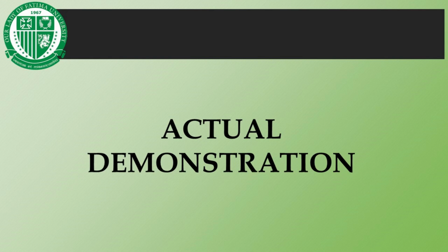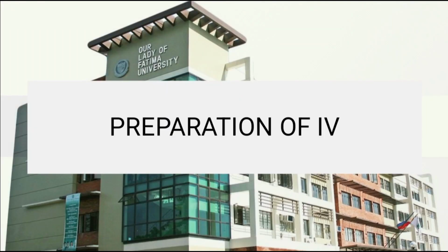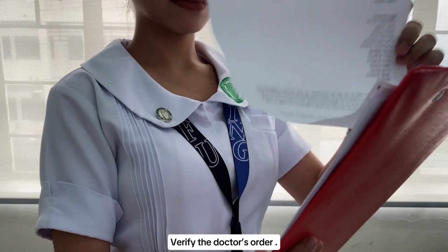Since we have sufficient knowledge about the preparation of IV insertion, blood transfusion, and IV removal, let's take a look at the actual demonstration for further understanding. In preparation for the IV, verify the doctor's order.